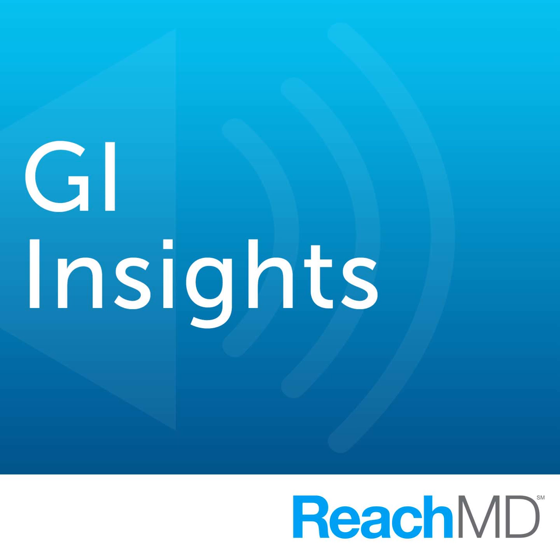Moshe, do you agree? Well, the data definitely point in that direction, and Jonathan and I and many other gastroenterologists around the country have been doing deep enteroscopy, either balloon-assisted or spiral enteroscopy. And anecdotally, it's not uncommon to find missed lesions either in the upper GI tract proximal to the ligament of Treitz or in the colon, particularly AVMs in the cecum.